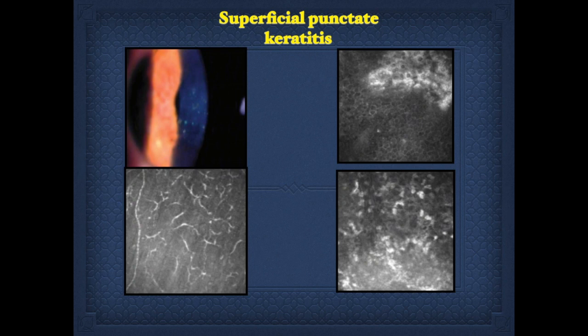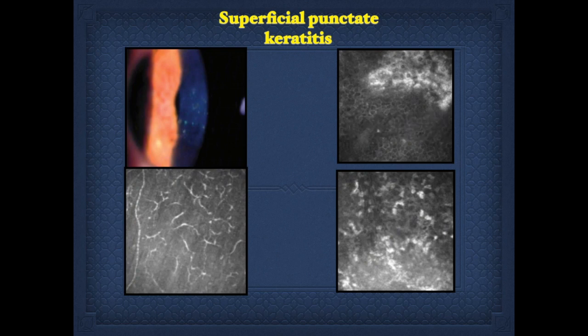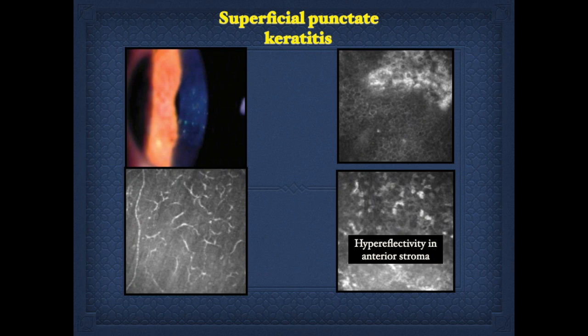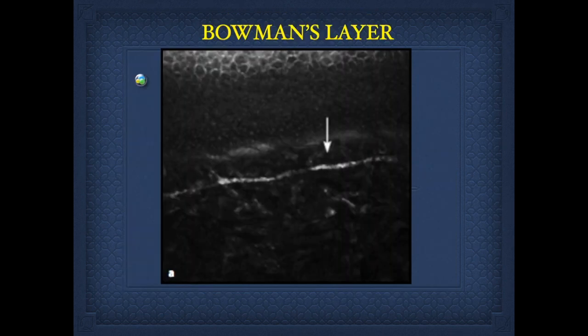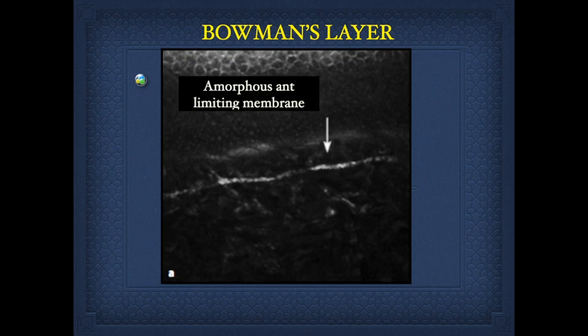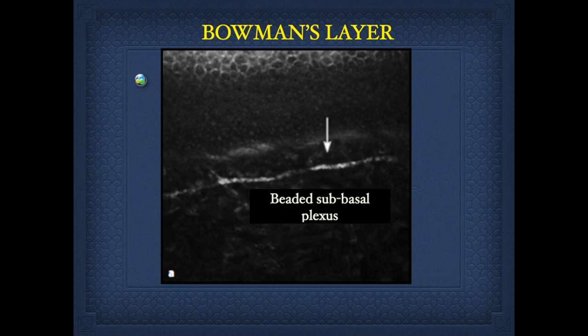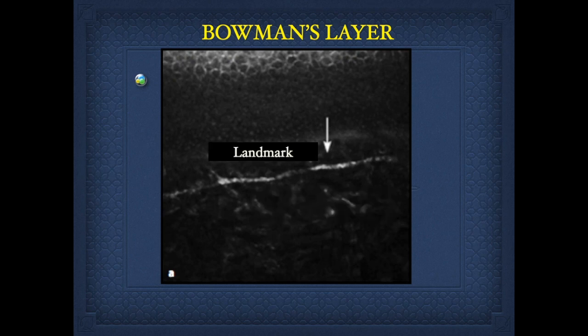Coming to practical applications in pathologies, this is an example of superficial punctate keratitis where we can see cell clusters in the basal epithelial layer. There are also increased Langerhans cells and hyper-reflectivity in the anterior stroma. Coming to Bowman's layer, it has an amorphous anterior limiting membrane, a beaded sub-basal plexus, and this serves as a landmark if there is any pathology in this layer.